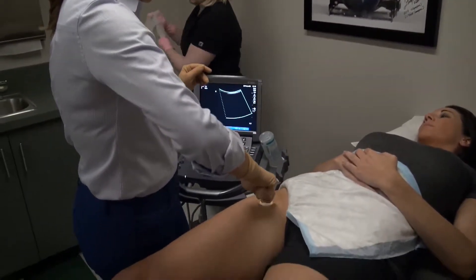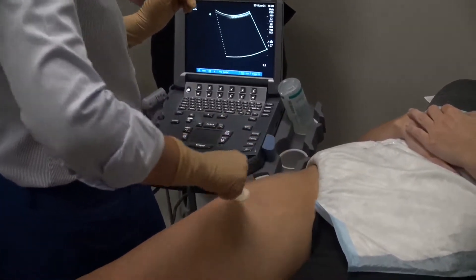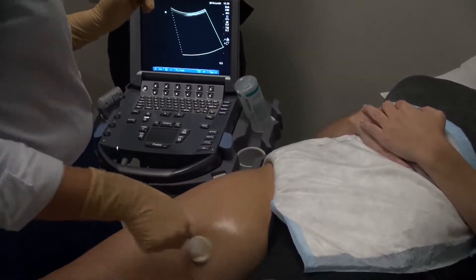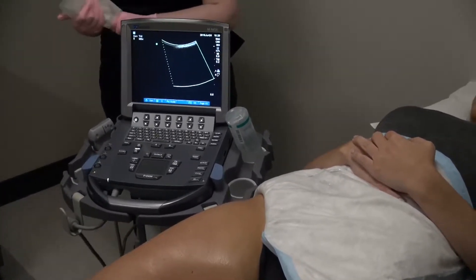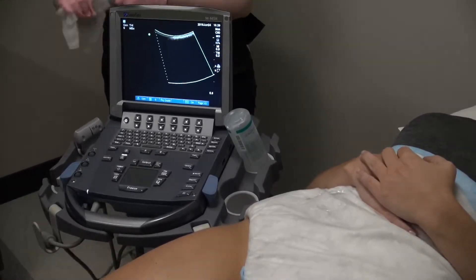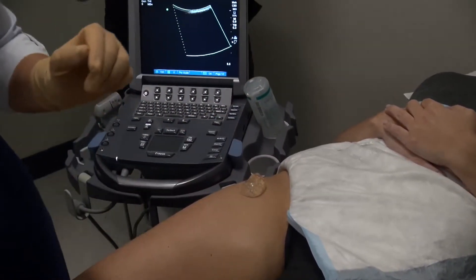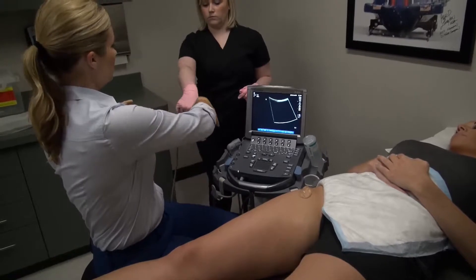The anterior hip is cleansed with a chlorhexidine swab. Betadine is not used as it can stay in the ultrasound transducer. The procedural assistant cleans the ultrasound transducer with a germicidal cloth, and sterile gel is placed over the anterior hip just above the targeted injection site. The provider then grasps the transducer, pulling the transducer and cord through the germicidal cloth.